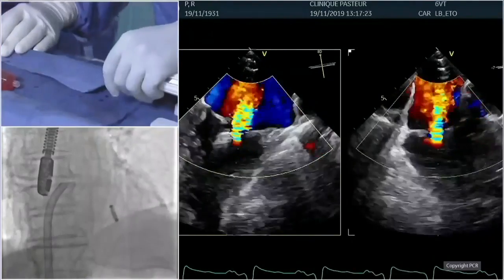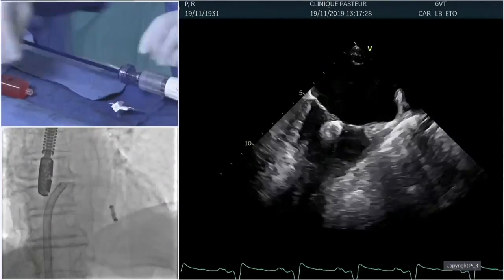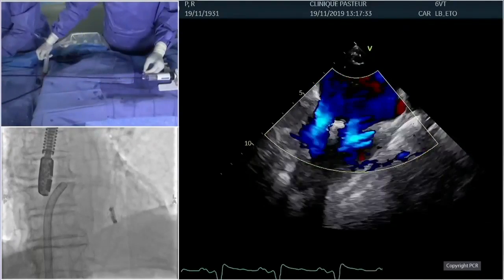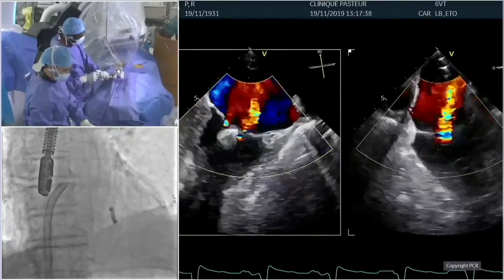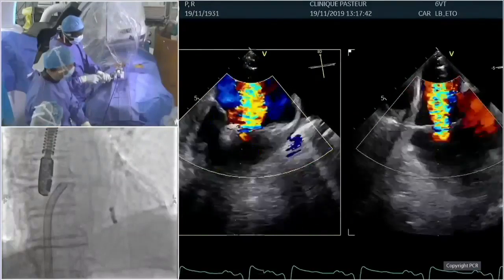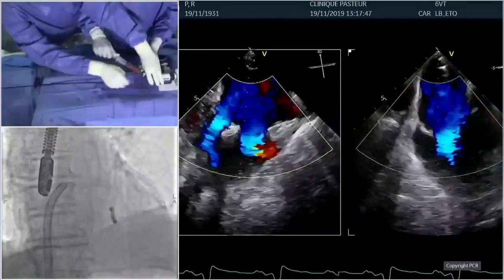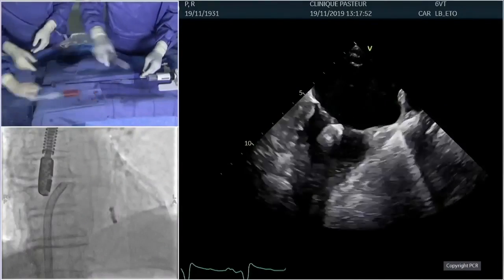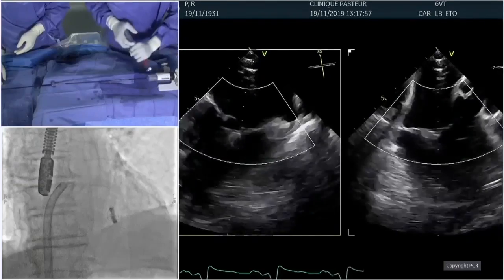Hendrik, we were looking at echocardiography to see what was the outcome here, how much reduction was. It's also possible to measure the pressure in the left atrium. It's been more and more common. Can you comment on what are we looking for with the pressure measurements? Yeah, many people do this now through that same access to have a pigtail in the LA. What is a very good achievement? I think it's easy to do, and it gives you quite worthwhile numbers. I don't know if they haven't done it here now, but I think it's easy to apply this to every procedure. And what you've seen here, I think it's quite interesting.